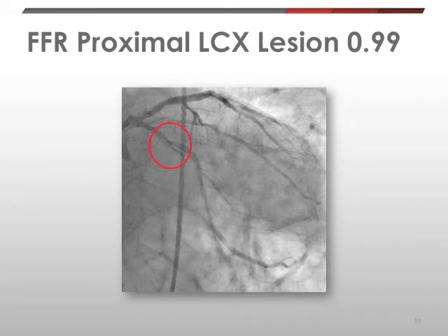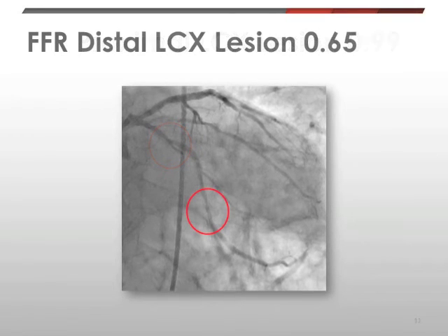We then measured FFR. The FFR proximal to the left circumflex artery is 0.99, and the FFR distal to the left circumflex artery is 0.65. This confirms using FFR that this is a significant lesion as well.